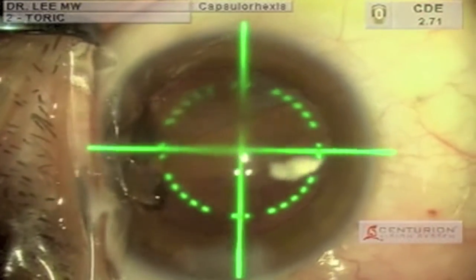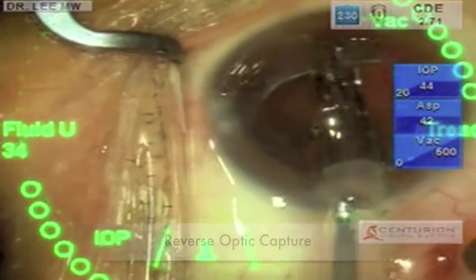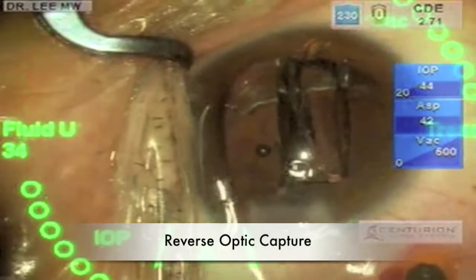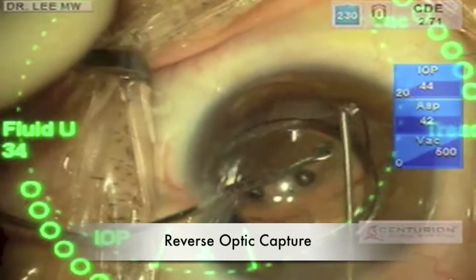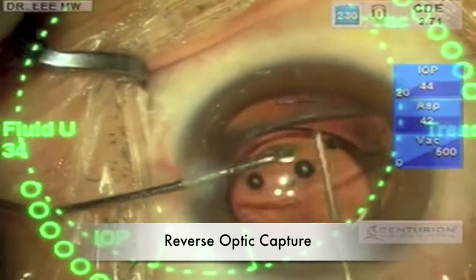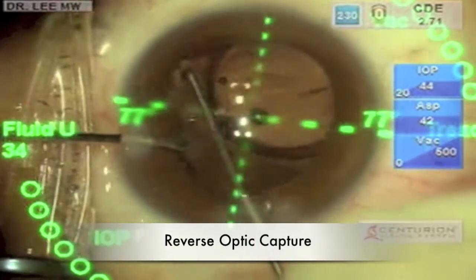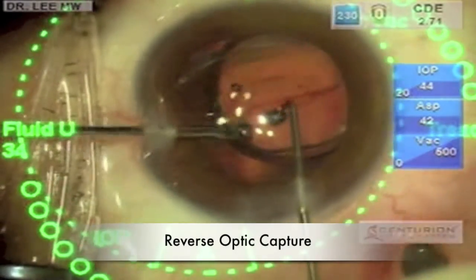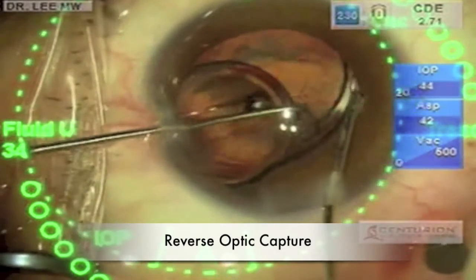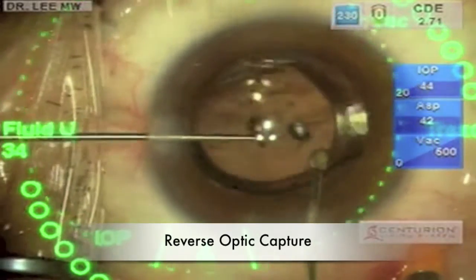An alternative method would be to perform a reverse optic capture. In such a case, the anterior capsule will have to be relatively smaller than the optic of the IOL to allow the single-piece IOL to be first inserted into the anterior chamber and subsequently have the haptics tucked into the bag with the optic sitting above it. In this example illustrated here, a toric intraocular lens was first positioned in the correct alignment and subsequently positioned by reverse optic capture.